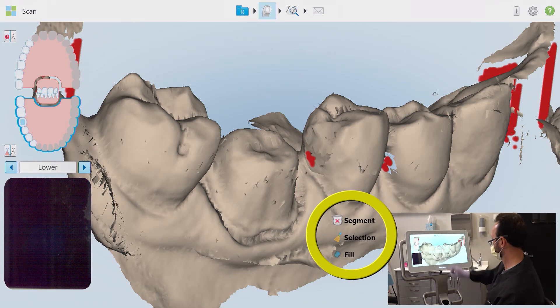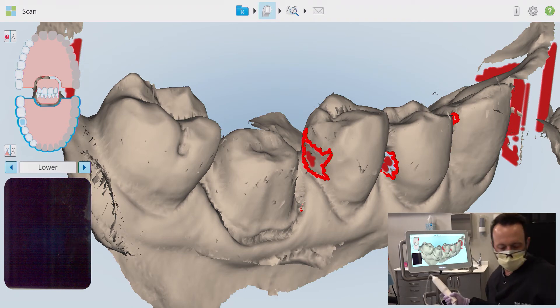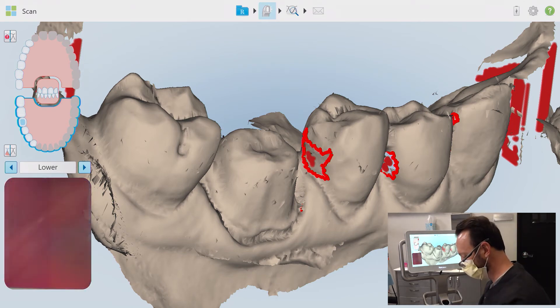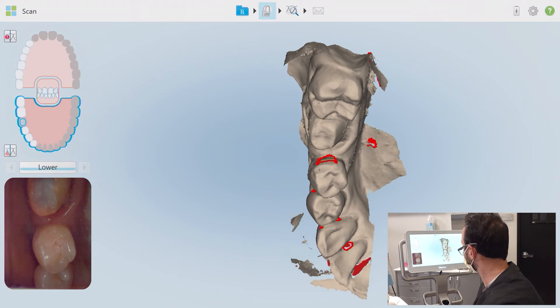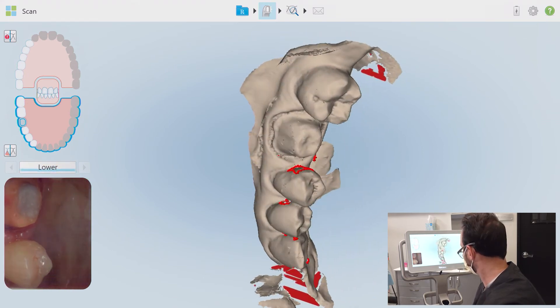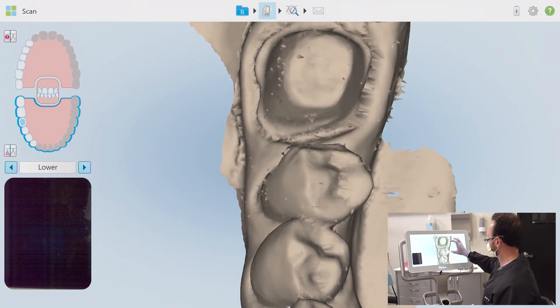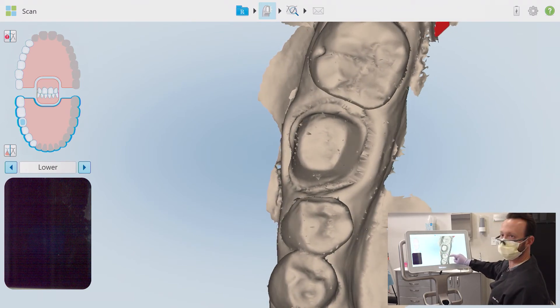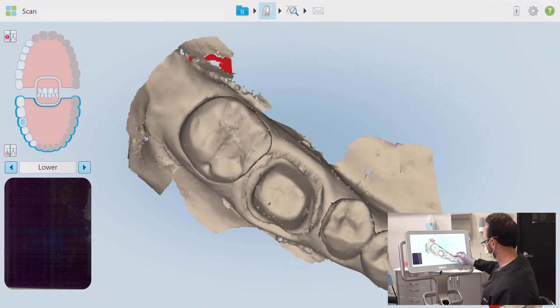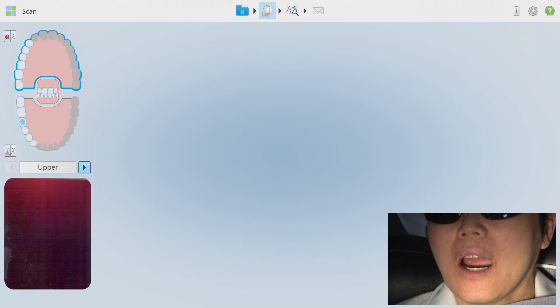I'll press and hold my finger on the screen until a secondary menu opens and then choose the fill option. The unit will take just a moment to process and suggest areas outlined in red that may need to be filled in. Once I start to scan again, no matter where I aim with the wand, only the missing data areas will be added to the segment. You can see those fill in nicely by really focusing on the missing points and exaggerating the tipping or twisting techniques discussed earlier. Another review after filling shows all missing areas are filled in to my satisfaction.